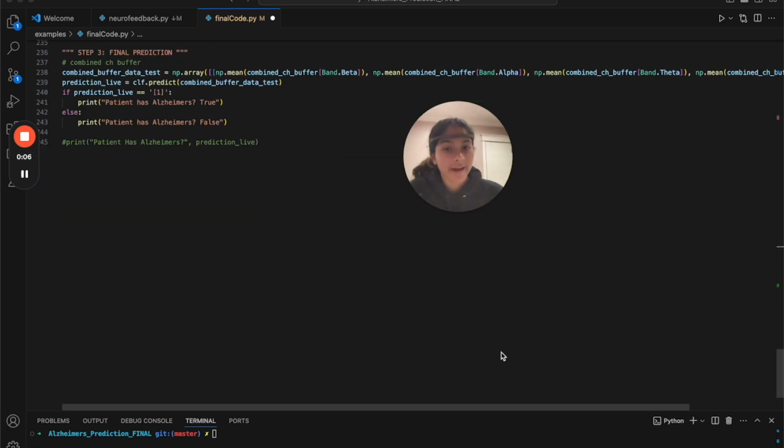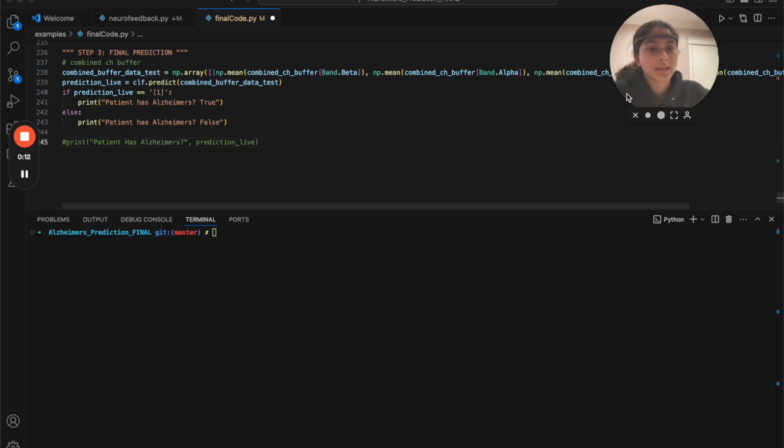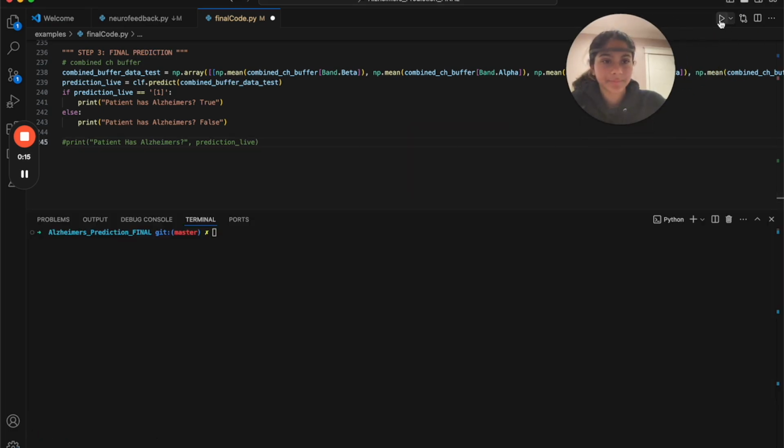The last and final step is the final prediction. By calling upon previous functions, this last part will identify to see if any of the input data matches the patterns of having Alzheimer's, which are decreases in alpha and beta and increases in delta and theta. If this model recognizes any of those patterns, it'll classify the user as having Alzheimer's. Now, time for the demo.